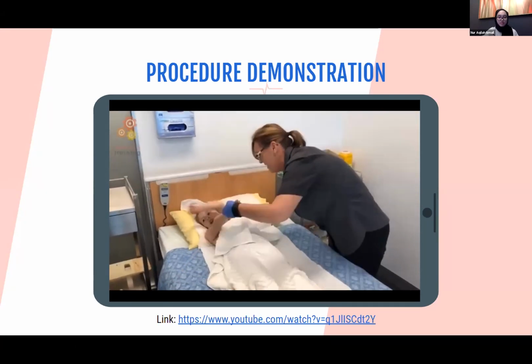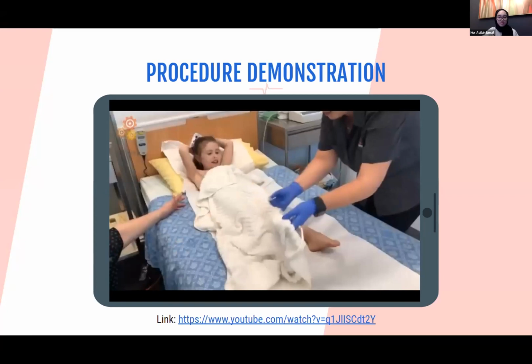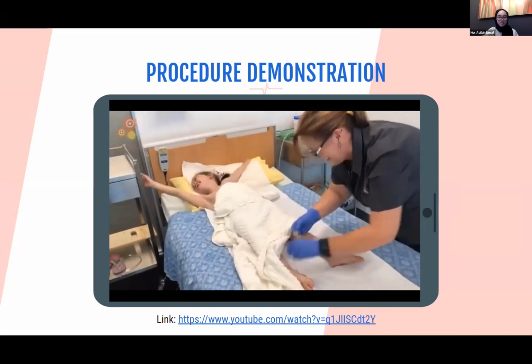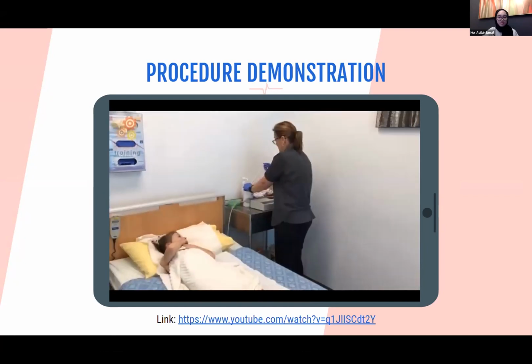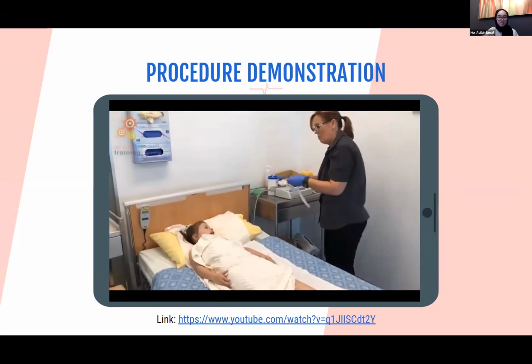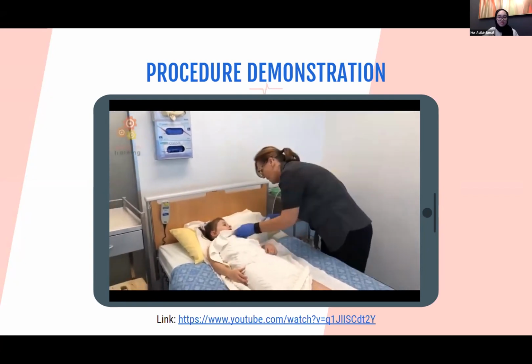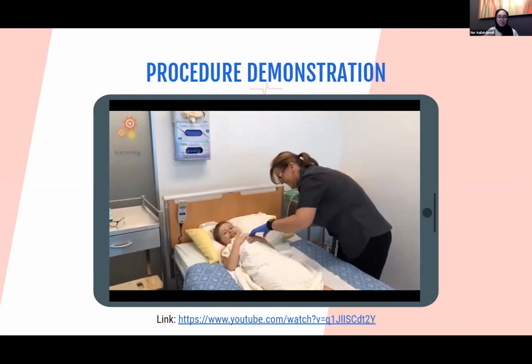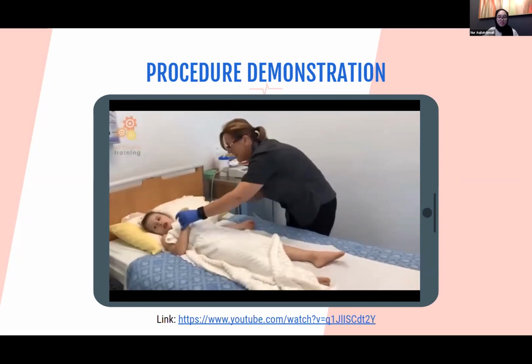I'm also exfoliating her wrists, and then I will do her ankles. And this one, and I'm just going to do your ankles as well, okay? Now we're just going to take the ISO wipes and we're going to wipe over the areas that we exfoliated. And we're going to do your arms.